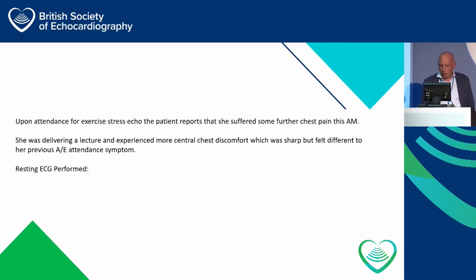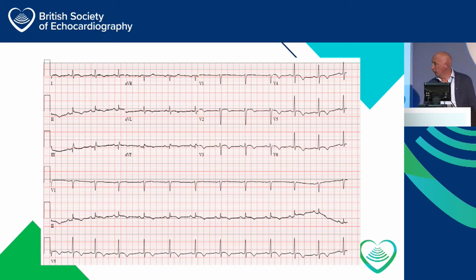She's delivering the lecture, she feels some more central chest discomfort, she felt it was sharp but a little bit different to previous attendance, so we do her ECG, obviously. She's come to clinic, we're doing the ECG. This is her ECG as she comes in to the clinic. So I'm sure you all know much more about ECG than I do. What we know, in addition to her ECG, is that we did a troponin. Have a quick look, because you can get it pretty quick if you ask for it.